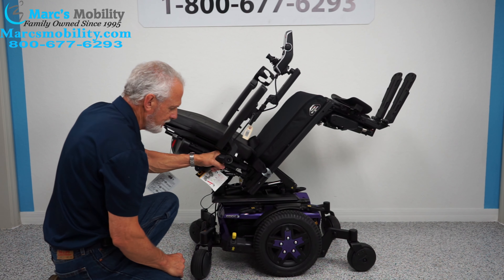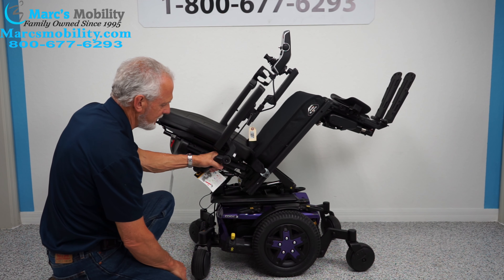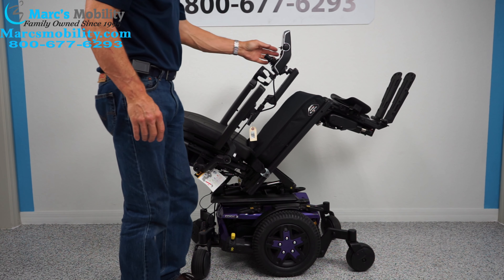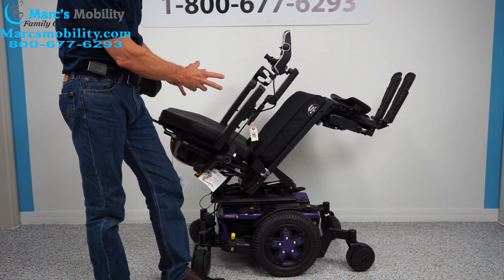Back in gear. You can see the suspension — we're back in gear. Just a nice power chair. Now I'm going to turn the power back on. This is your tilt.